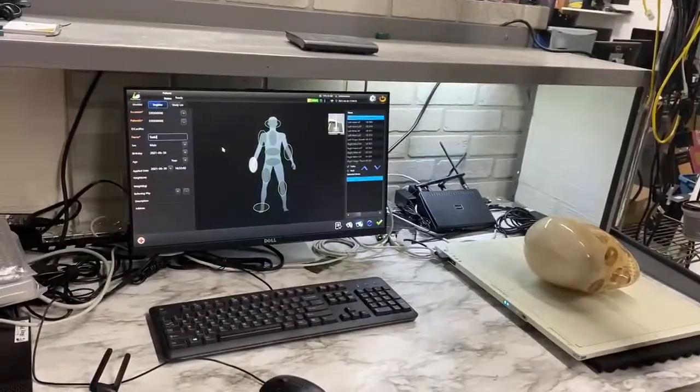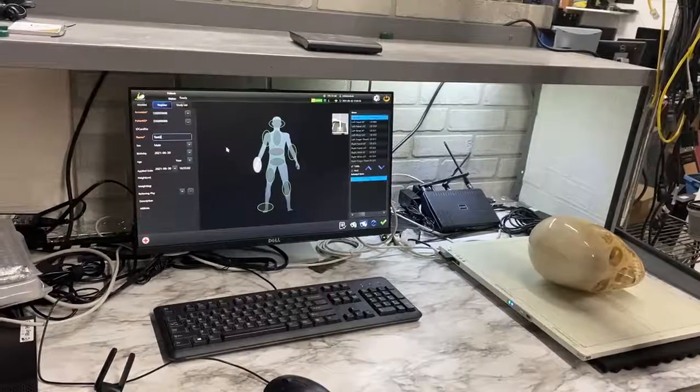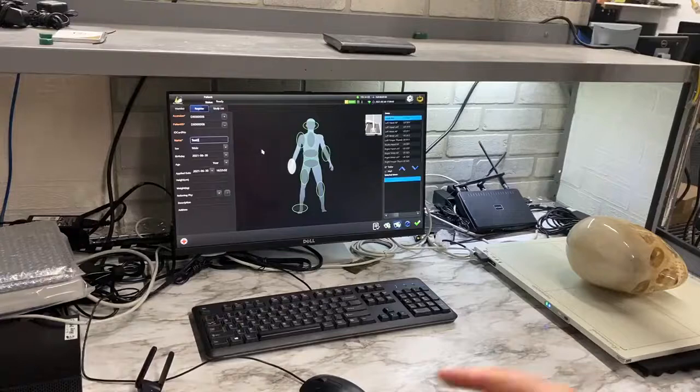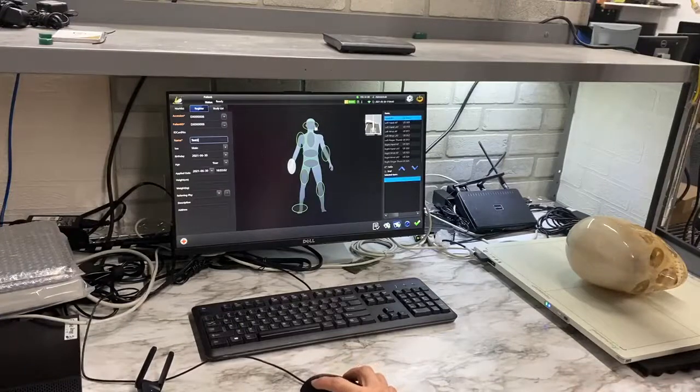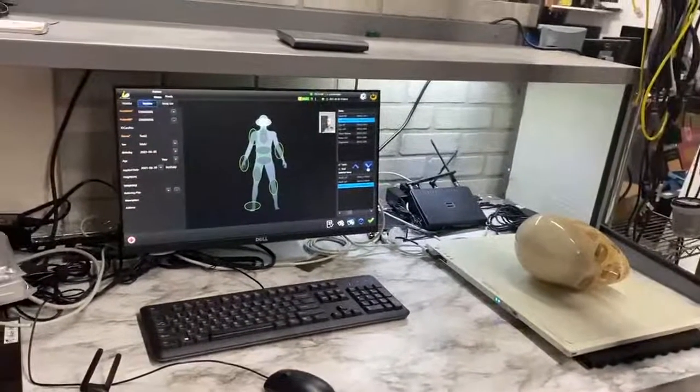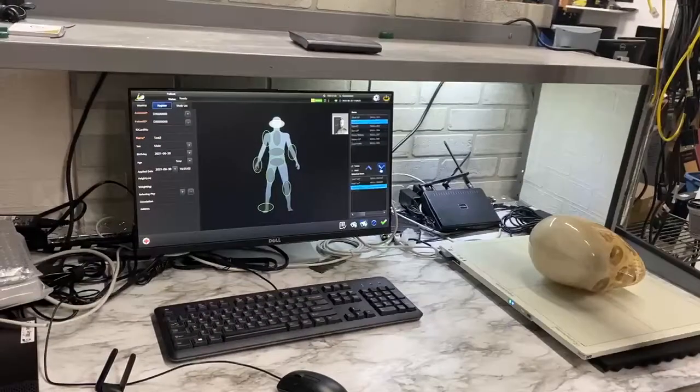We're ready here to go do a test. We're at the registration page where it comes up. I'll put in the name test2. We've got our skull phantom on here, so I'll pick a skull lat and pull a few down here, and we can see that we're connected with the lights there. So we're ready to take an image. I'll step away.